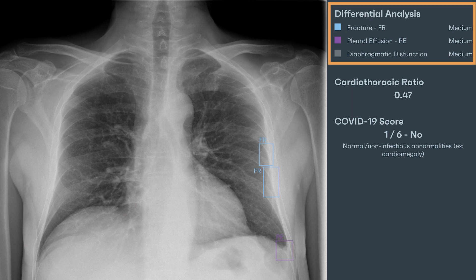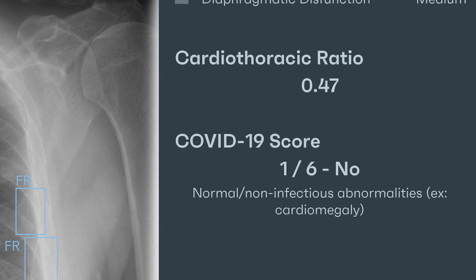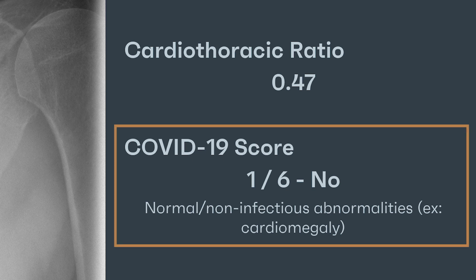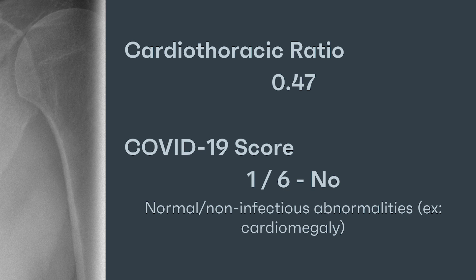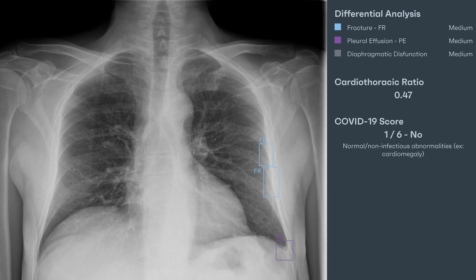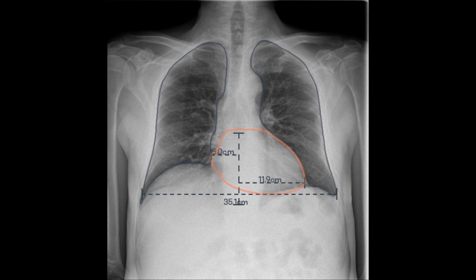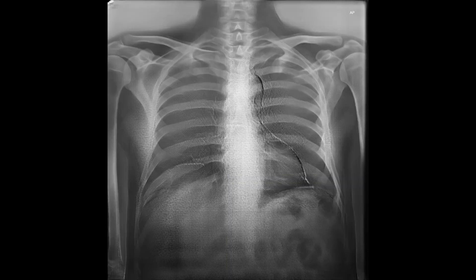Besides identifying and localizing the most common lung pathologies, Rayscape generates a series of additional information essential for a comprehensive pulmonary evaluation. The COVID-19 score is an adaptation of the CORADS score and is an essential screening tool for detecting patients with SARS-CoV-2 infection. To save time, Rayscape automatically measures the cardiothoracic index ratio and is able to generate bone-suppressed and subtracted versions of the original image without the need for double exposure.